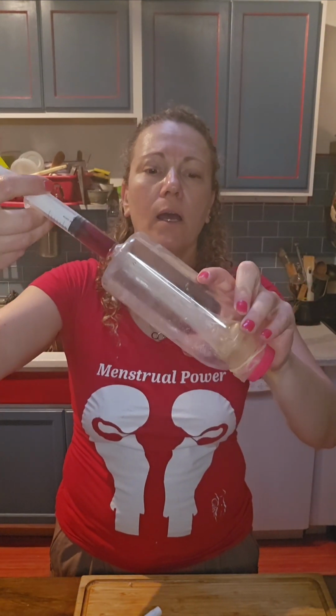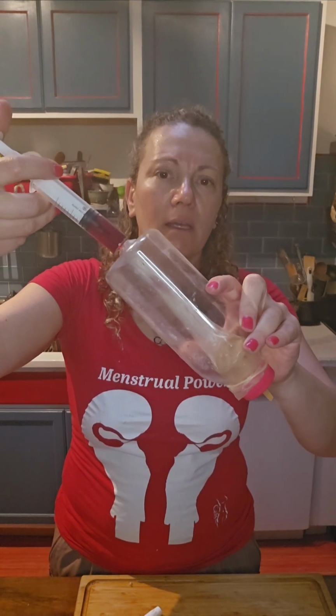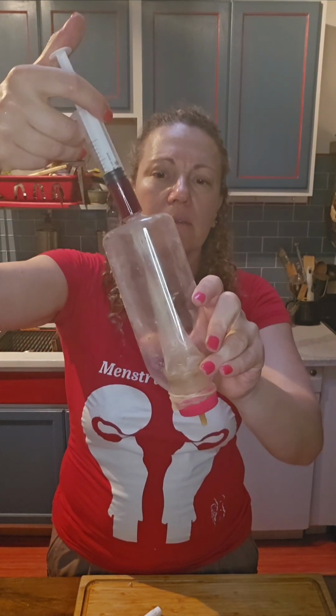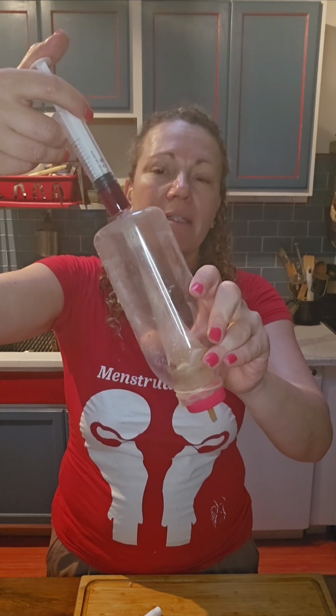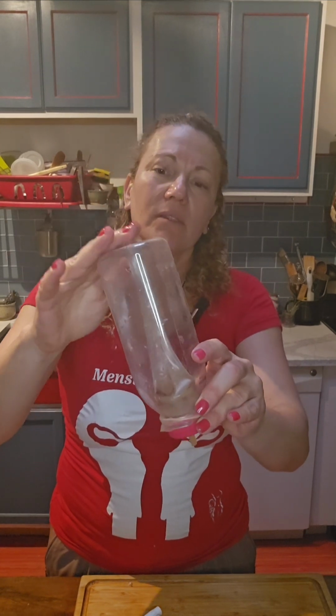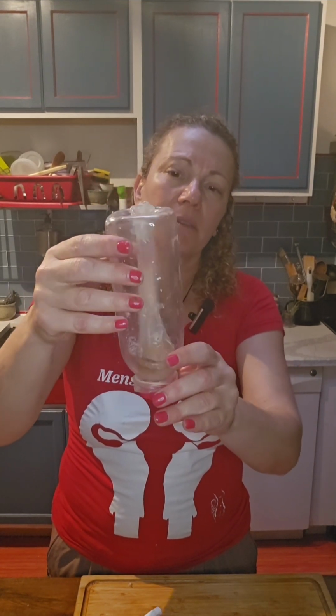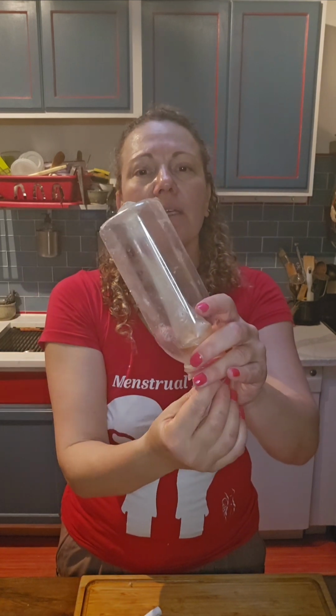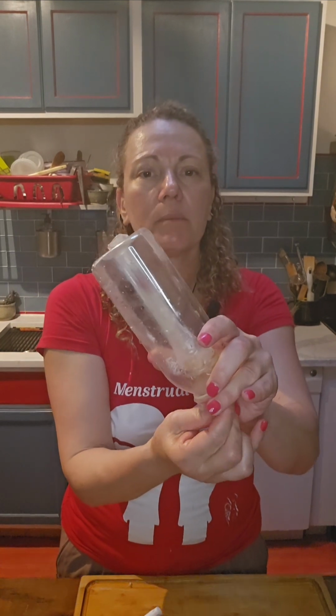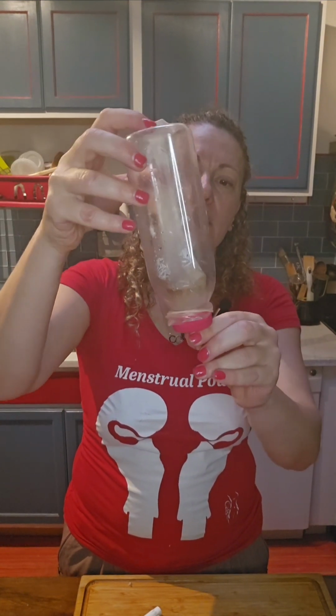and show how the cup collects the vaginal secretion. So we have here a little bit of bubble, and then once again, after we demonstrate, we take it out.